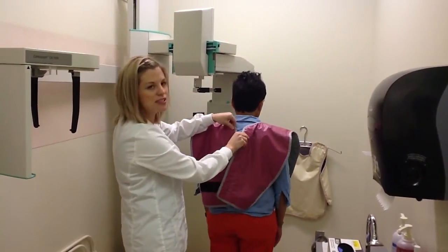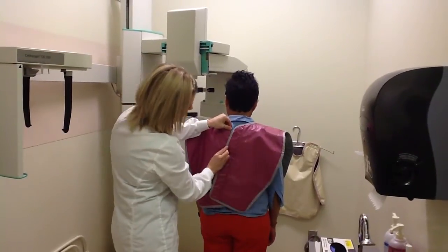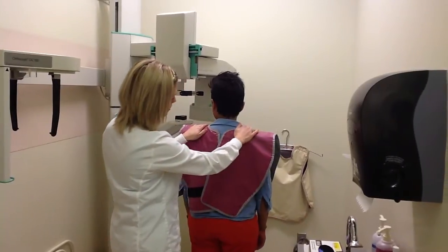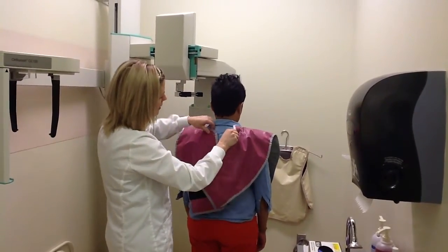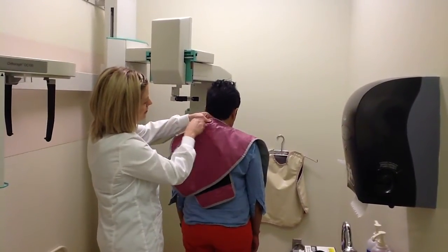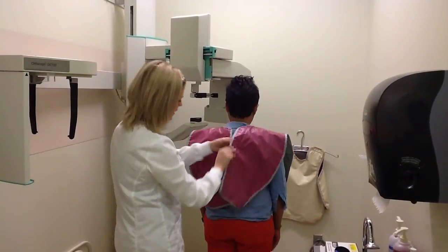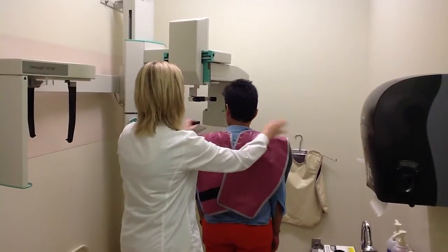So for our patients, we want to have it attached and closed with the Velcro here and evenly on the shoulders. We really want to avoid having it too high on the back of the neck here because that could impact the quality of our image. So I'm going to place it here and attach it. Are you okay there? I'm good, thank you.